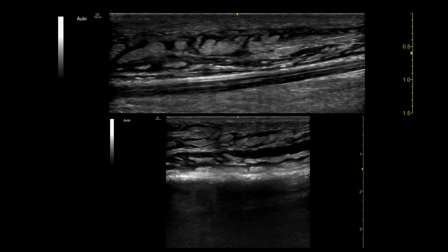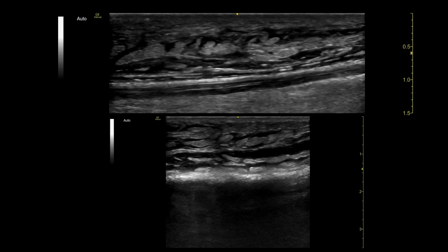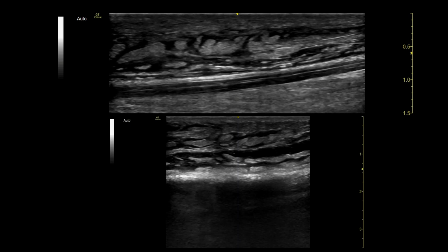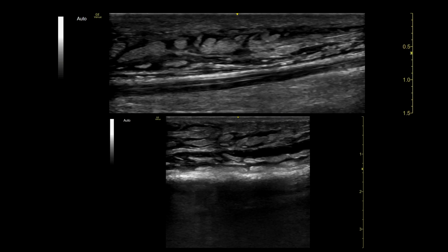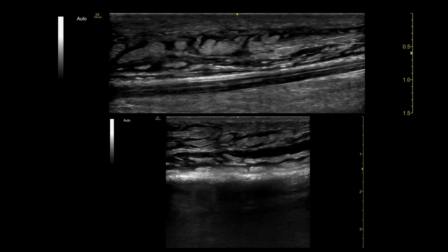You can use this sign every day, like proving that the patient is diuresing and the edema is being moved. Also proving that cellulitis is improving. You can also rule out the presence of gas. You can rule out the presence of abscesses.